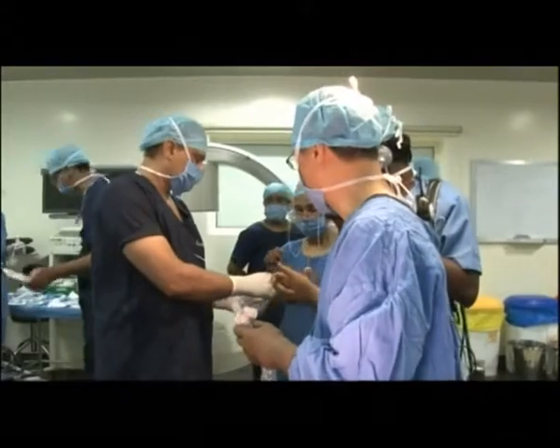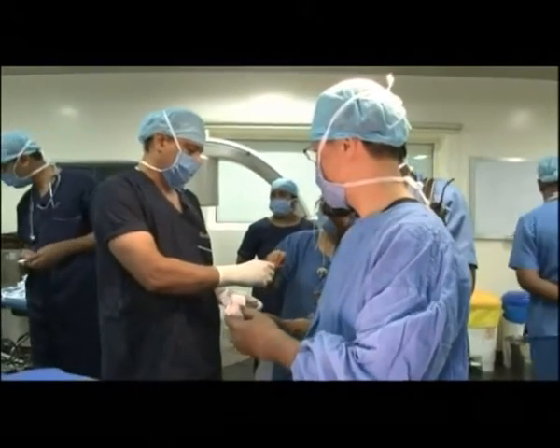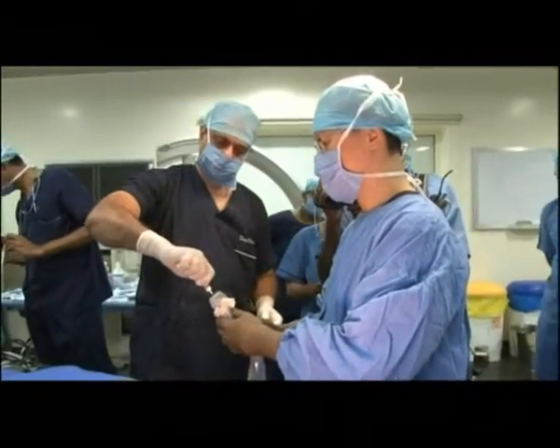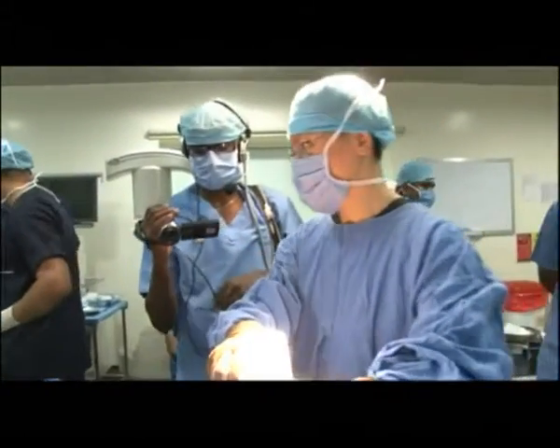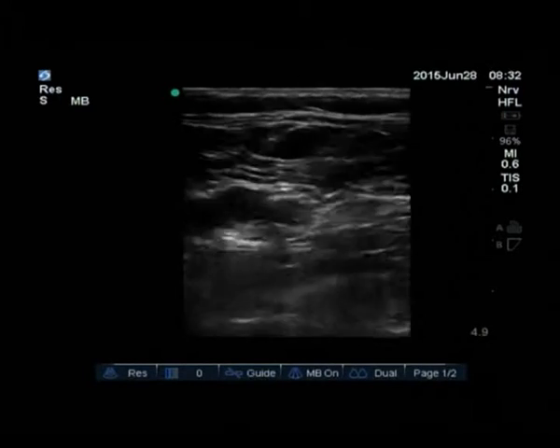And the probe is getting prepared. Bala? Yes. Just before you give the dexmedetomidine, also give midazolam and fentanyl, which would be a helping hand.